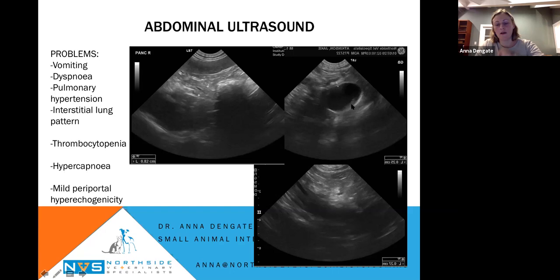And his gallbladder wall just looked really marginally thickened, but it's potentially got a tiny little tiger stripe there. So I wouldn't necessarily describe it as edematous. I'd just describe it as subtly thickened. And then we've got that bright fat around the periportal region.